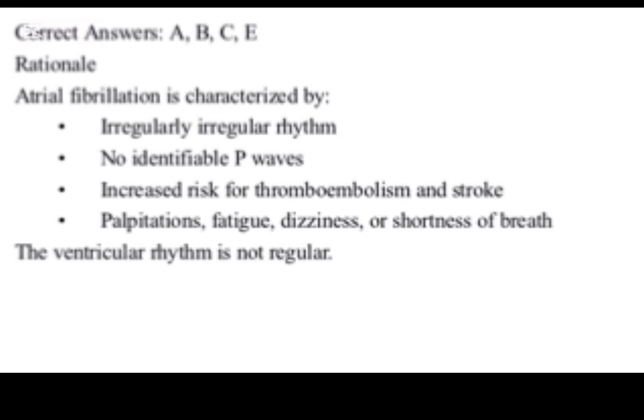Rationale. Atrial fibrillation is characterized by irregular rhythm, no identifiable P waves, increased risk for thromboembolism and stroke, palpitations, fatigue, dizziness, or shortness of breath. The ventricular rhythm is not regular.